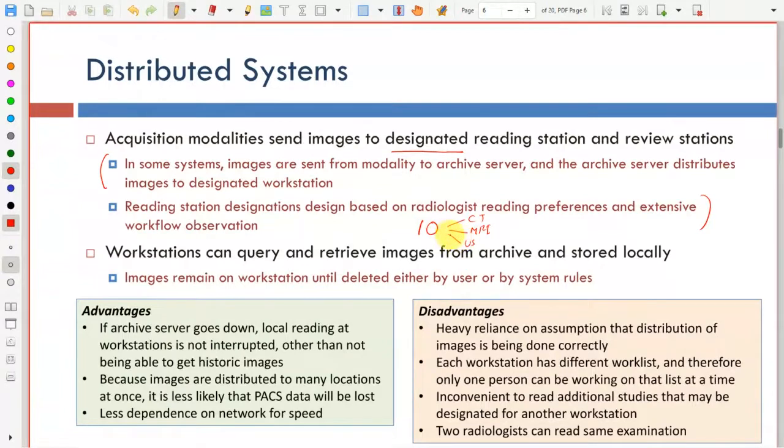First of all, you have to make sure that the workflow you have is observed. Meaning that if each day, for example, you're going to have 100 cases of CT and only 10 cases of MRI and probably 200 cases of ultrasound, then you have to divide them to take that into account. So probably you're going to have only one MRI, maybe 3 here and probably 6 here, so that you can take into account how these cases are going to be handled.